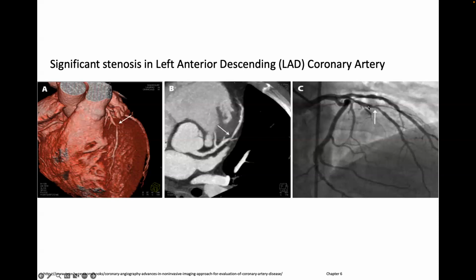On an X-ray angiogram, this is a significant lesion. So it's like a more than 50% reduction in diameter from here to here. And then if you go distal, it gets bigger again. So this thing here should be at least this big, and it's not, right? And so that would be called positive.